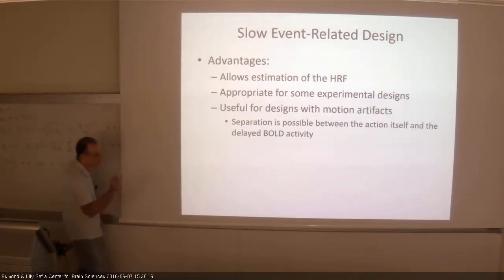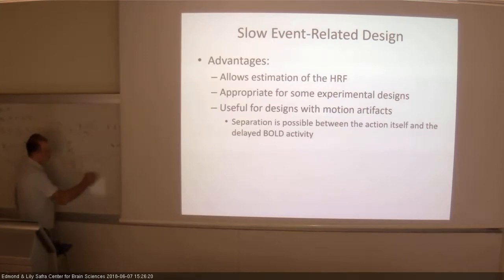If you want to, let's say, tease apart some elevated response, you have some elevated response and you want to see if it's a motion artifact or not. If you have the whole timeline of the response, a motion artifact behaves differently than an HRF.